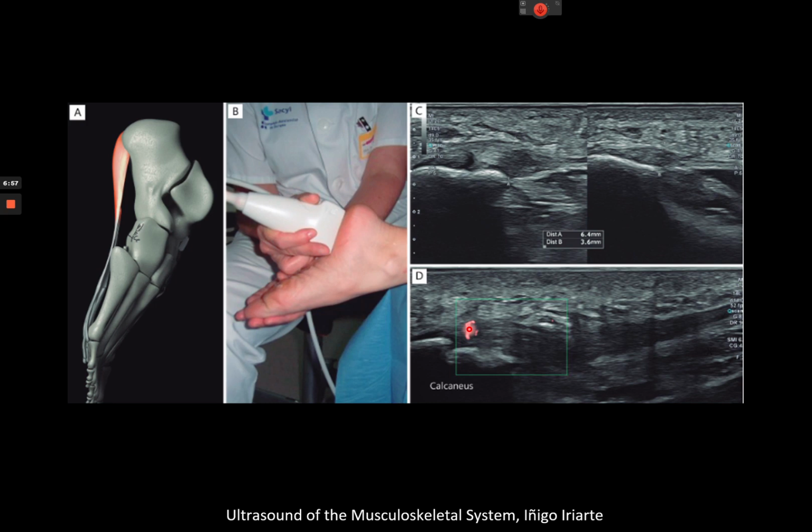You need a very, very sensitive machine to pick that up because plantar fasciitis is typically not very vascular, as is, say, you might get infiltration of a mid portion of an Achilles. It doesn't usually happen with the plantar fascia, but if it's quite inflamed or the person's had an intrasubstance tear, you will see some inflammation in that area, and that will often show up with a bit of hyperemia.